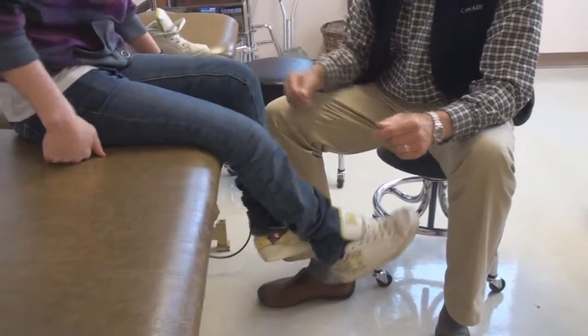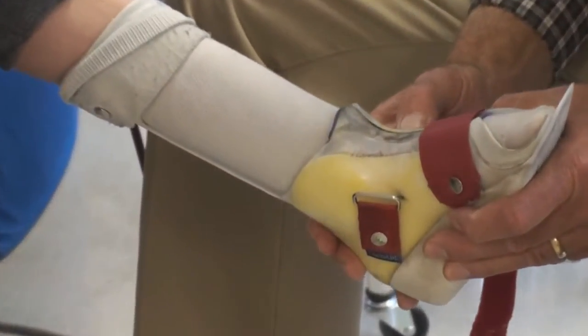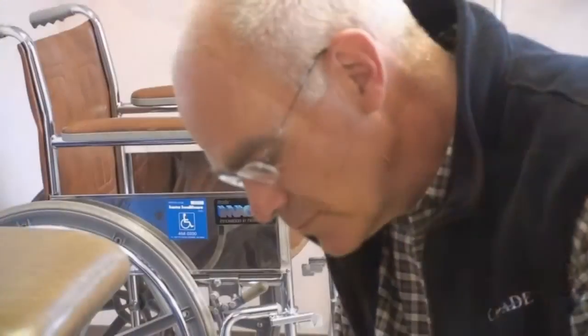When you come into our facility and you need a brace, you could say that in some way you lack the control of your legs, which is what we specialize in — or arm occasionally — where you need help maintaining a position.